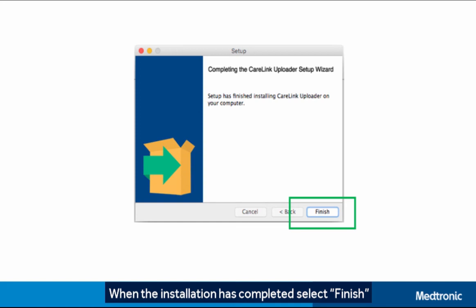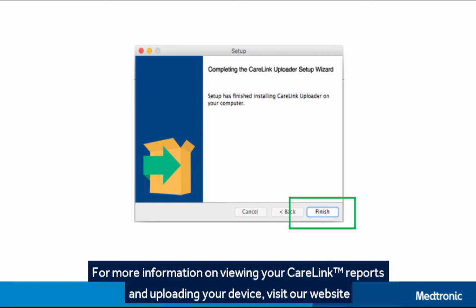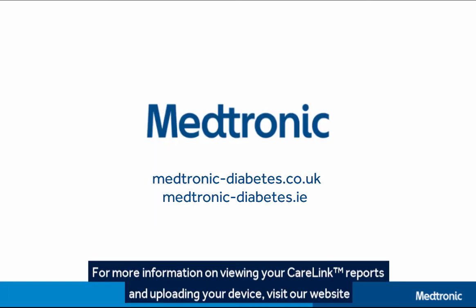When the installation has completed, select Finish. You're now ready to upload your pump data into CareLink. For more information on viewing your CareLink reports and uploading your device, please visit our website.